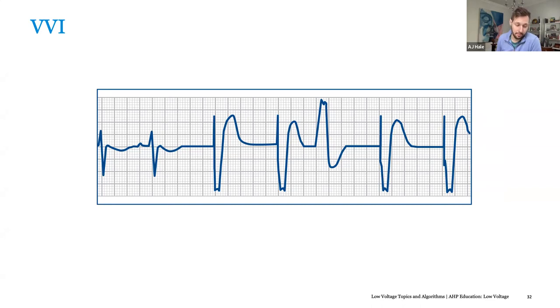So if a patient's going in for surgery, for example, and even though they're dependent, we know they have PVCs, or they're not dependent, but they have intermittent pauses that are relatively frequent, so we decide to put them asynchronous. My recommendation would be to go VOO 80, VOO 85, 90 even, maybe even 100 in some cases. And the reason being, as you said, to limit the instance of this competitive pacing.